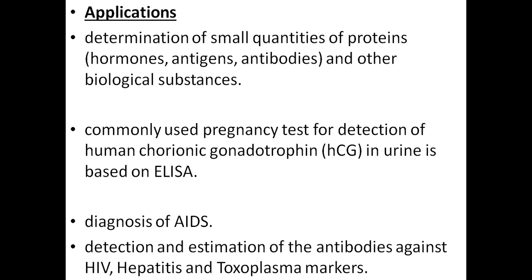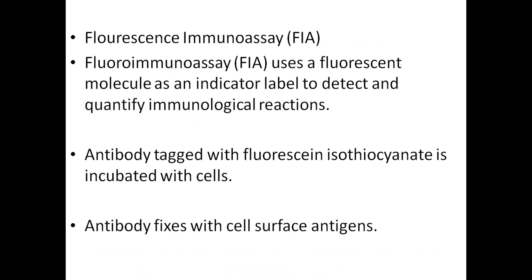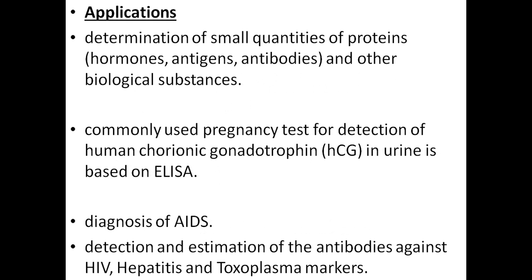Then diagnosis of AIDS can be done by using ELISA. Detection and estimation of antibodies against HIV, hepatitis, toxoplasma markers, all these things can be done by using this enzyme immunoassay technique. That is about the enzyme linked immunoassay technique.